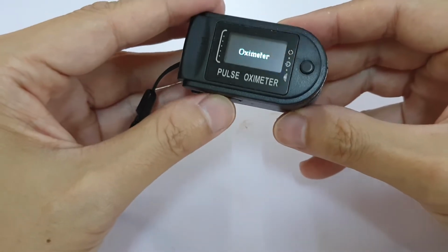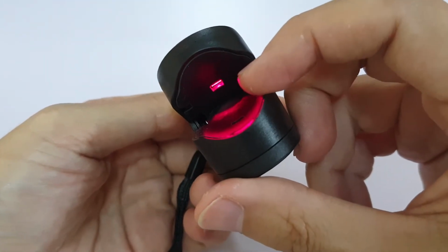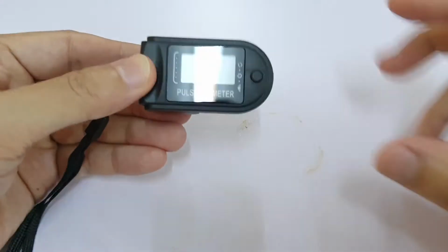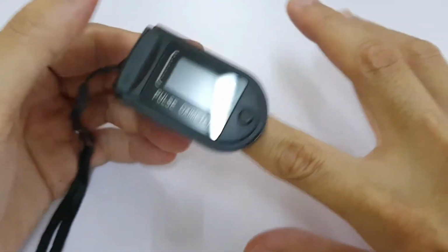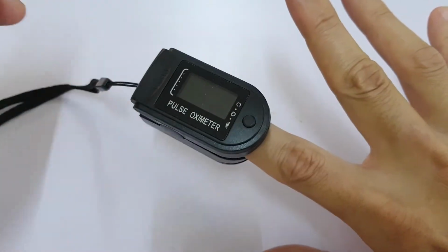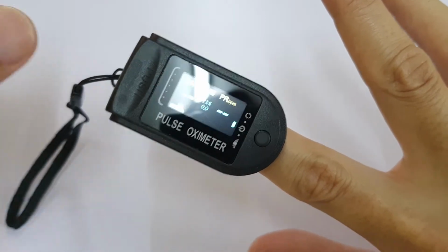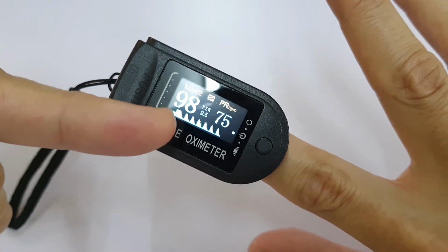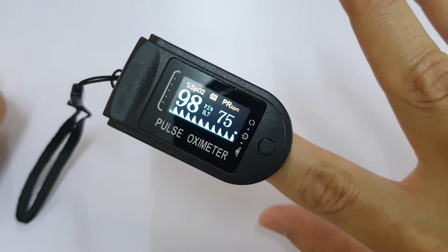When you turn it on, it powers on the oximeter, and then the rate sensor comes on to actually measure your heartbeat as well as your oxygen saturation. If it doesn't detect a finger, it will turn off by itself. If I put in my finger, usually it's recommended your forefinger, that means your second finger, or your middle finger. So let's use our forefinger. If you breathe as normal, you can see the heartbeat chart says that I'm at 98% at 75 pulse per minute.